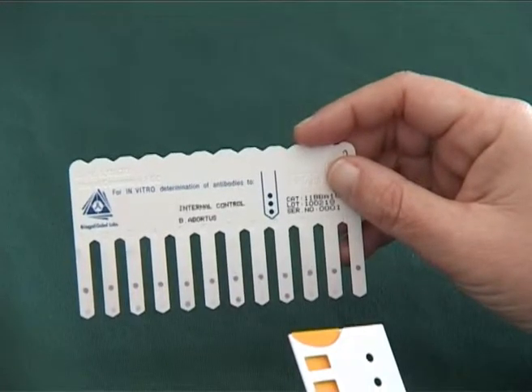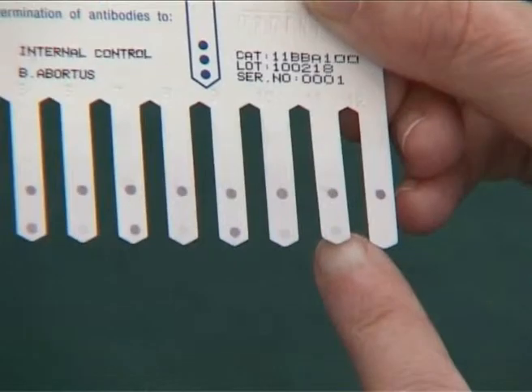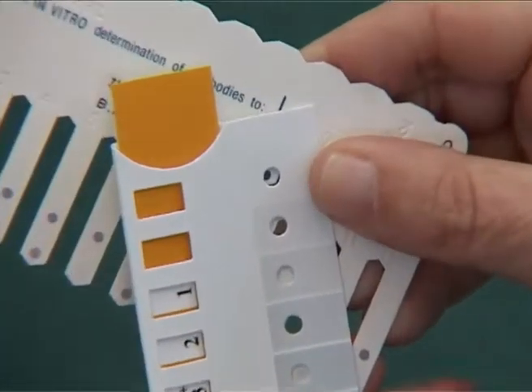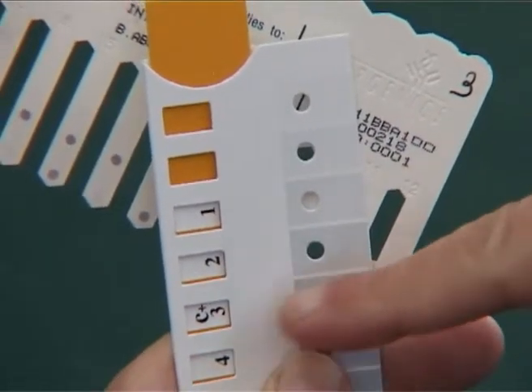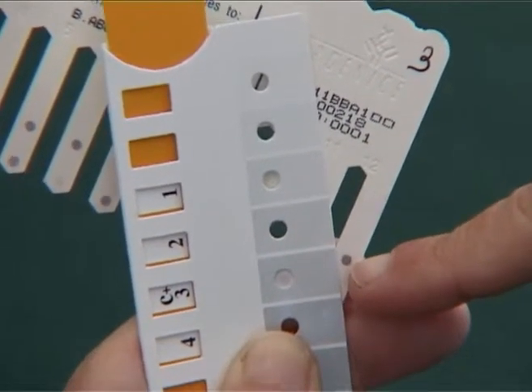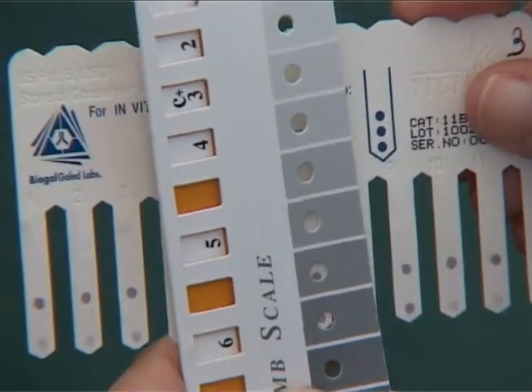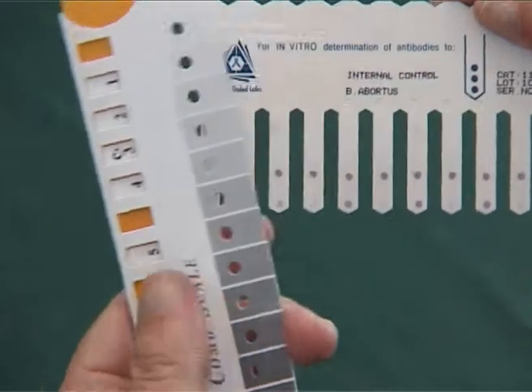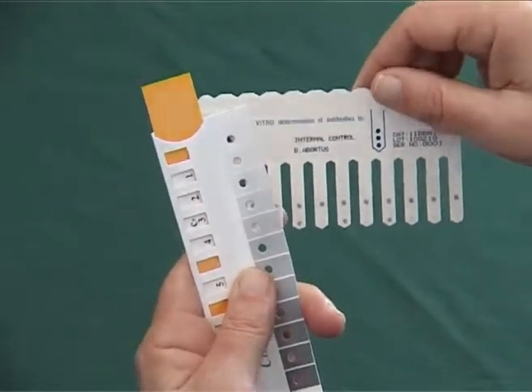When the comb is completely dry, align the comb scale and compare the colour obtained with the positive control colour scale, and slide the slider until C plus 3 appears in the window. Finally, hold the slide in this position during the reading of the sample, choose the most suitable colour, and read the titer in the yellow window.